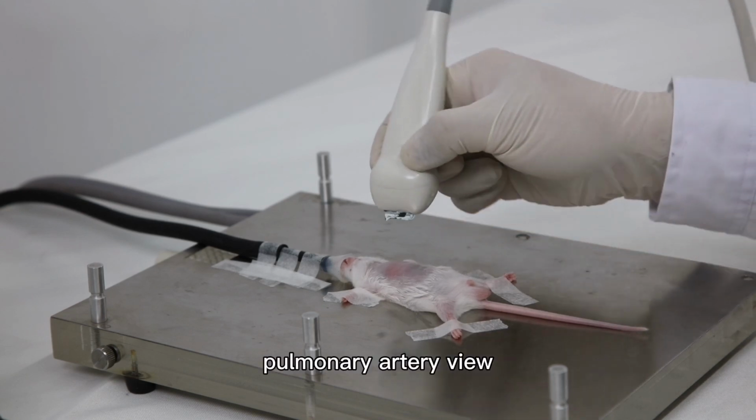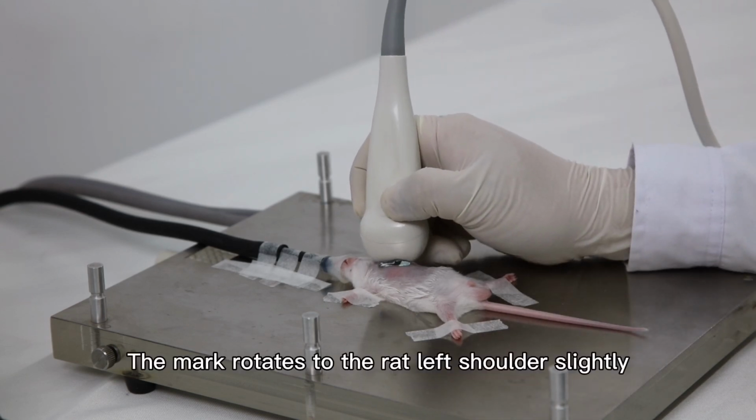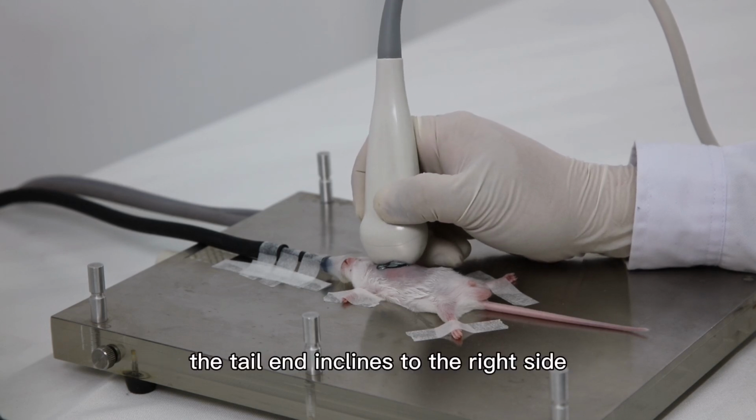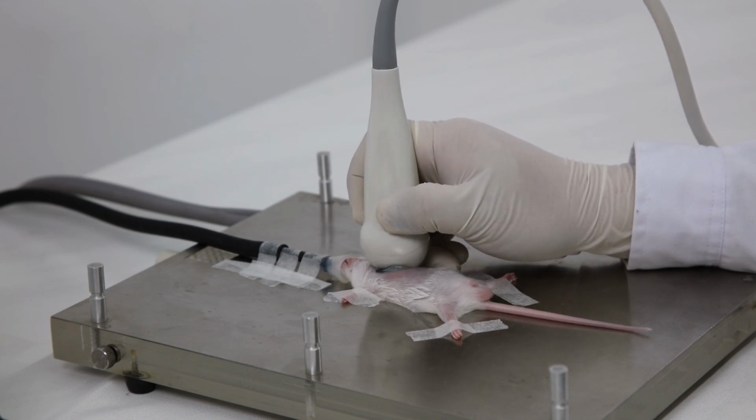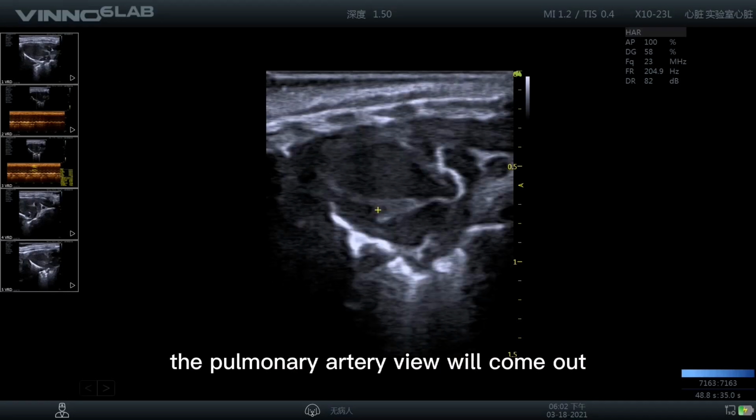Pulmonary artery view. The mark rotates slightly toward the left shoulder. The tail end inclines slightly to the right side based on the position of the long axis. The pulmonary artery view will come out.